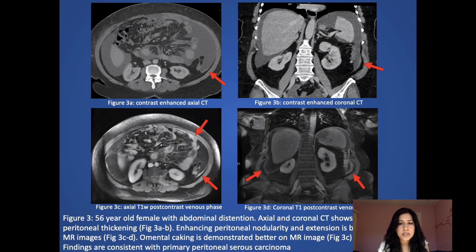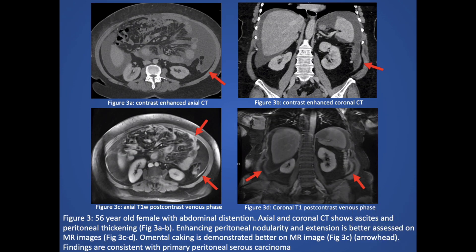Here is a 56-year-old female with abdominal distension. On the top row, the CT findings show ascites and peritoneal thickening. These findings are better assessed on the bottom row MR images, where you can see enhancing peritoneal nodularity and the extension of the disease with omental caking. These findings are consistent with primary peritoneal serous carcinoma.